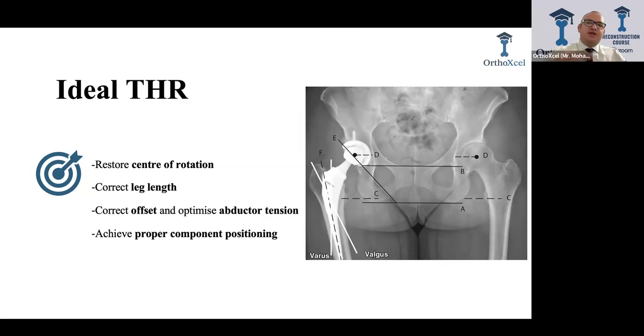So imagine when you have your implant in varus or valgus, when the patient starts to load, if it is in valgus, you're putting all the load through the lateral cortex. It's much better than being in varus. If in varus, you're putting all the load through the medial cortex, and you're buying a failure. You're trying to get this implant to fail by putting the stem wrongly in varus or valgus.